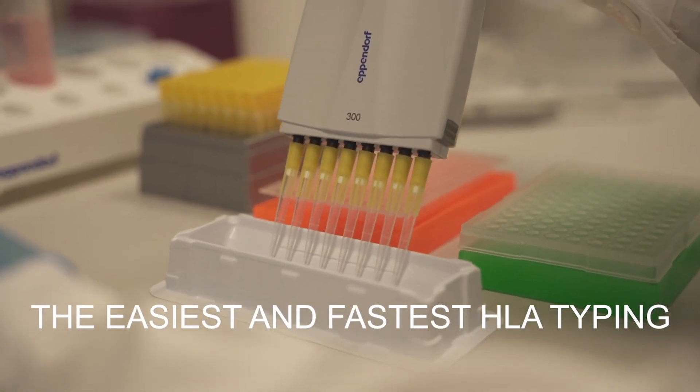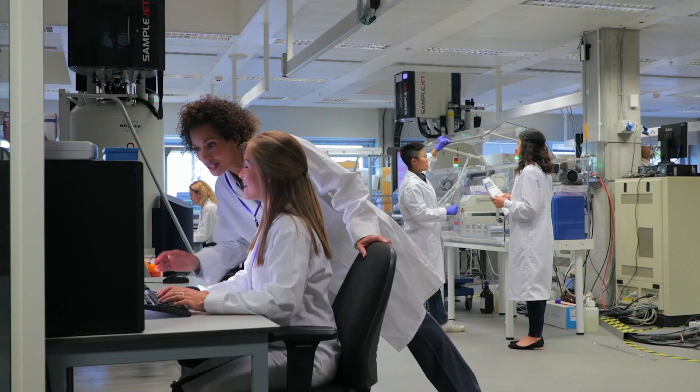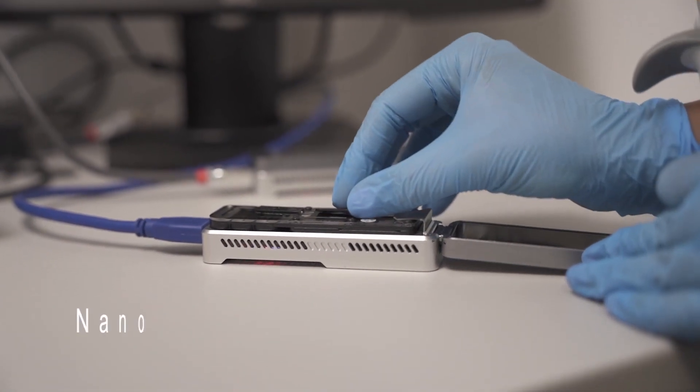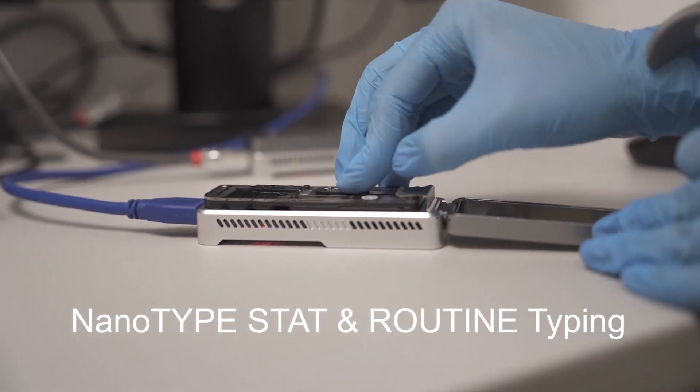The NanoType library preparation is fast and easy. Labs can scale up from 1 to 96 samples and can simply do urgent or reflexive testing of single samples or registry typing of multiple samples.